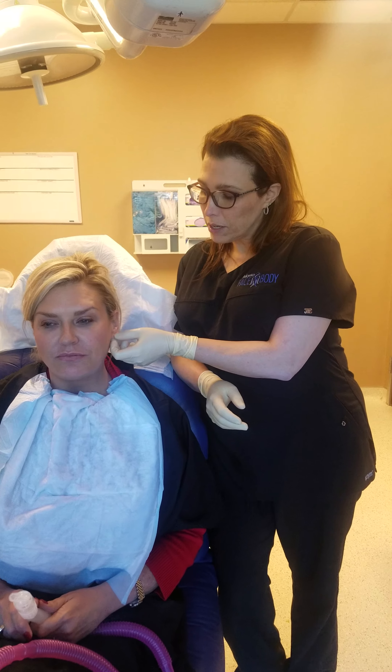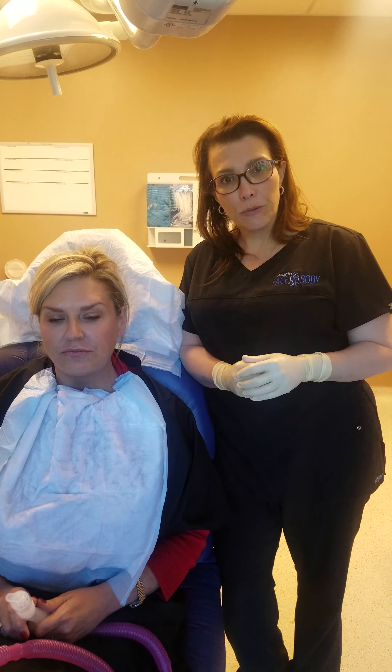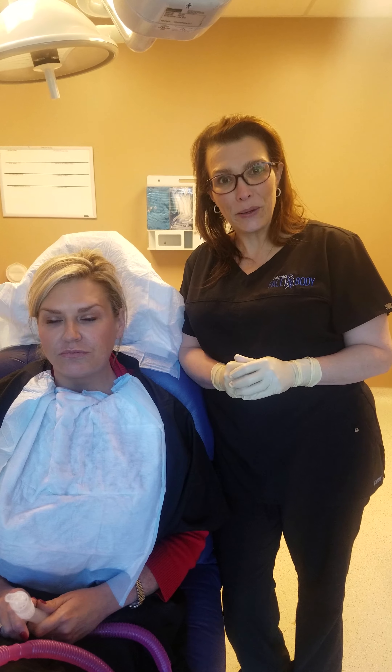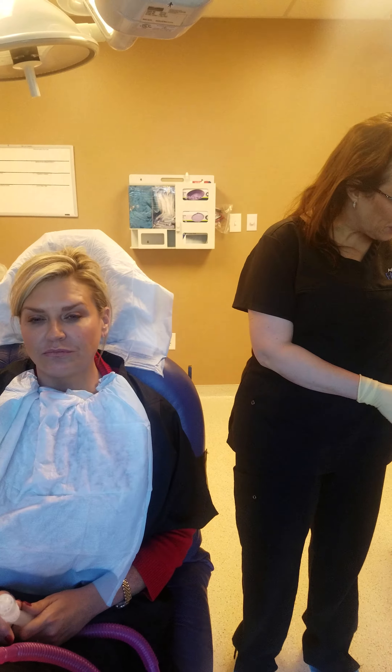She's had an earlobe repair before, but it's pulled through a little bit, so we're going to put in a little filler to help support her earlobe and her earrings, and make her earlobes look a little better and her earrings wear a little bit better. So we're going to get ready to do that right now.